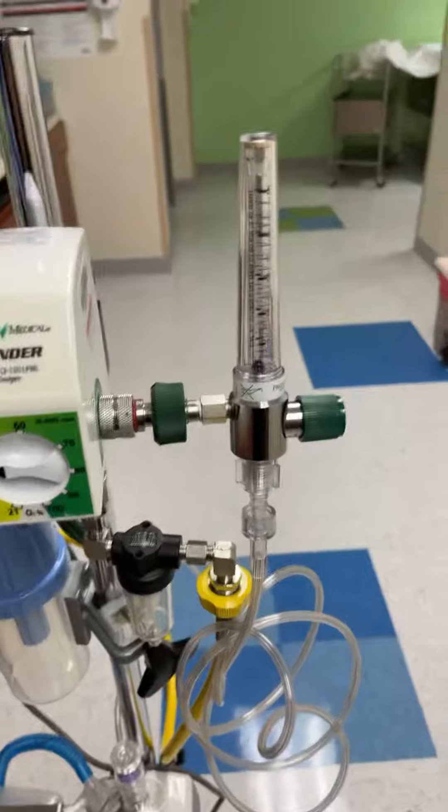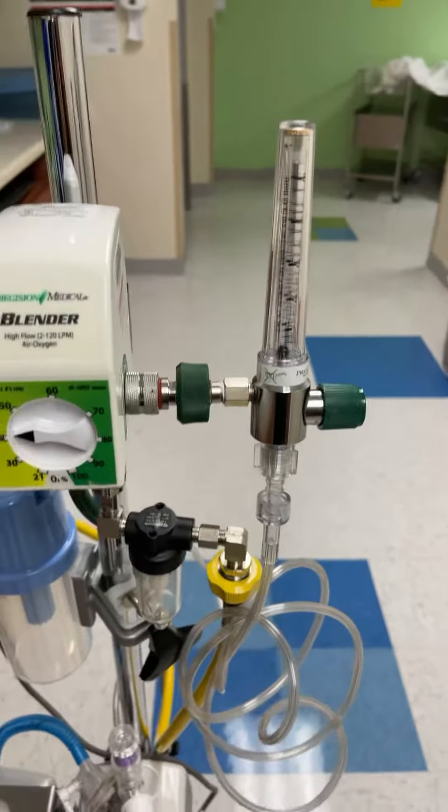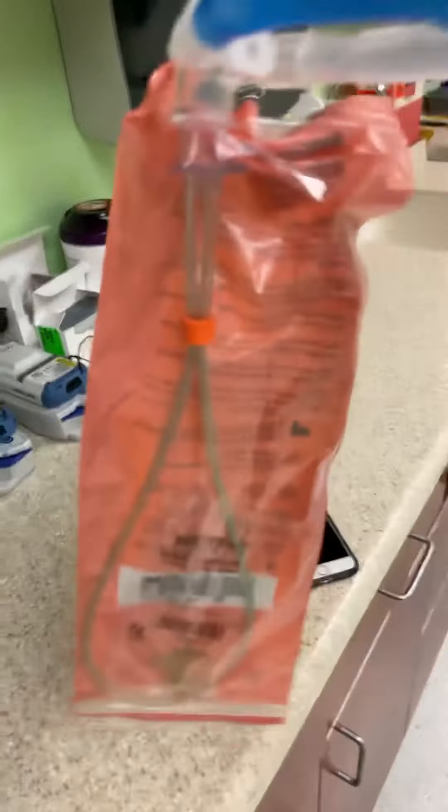Basically you want to set this thing at about 10 liters — just enough so you can hear it bubbling pretty good. It's a regular ventilator circuit with a ram cannula hooked on the end.